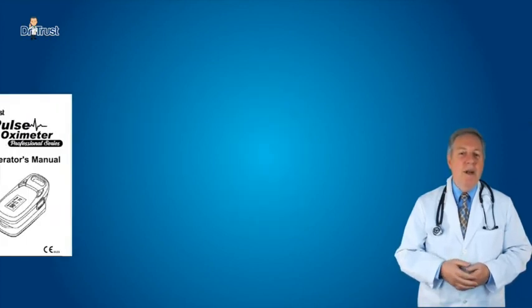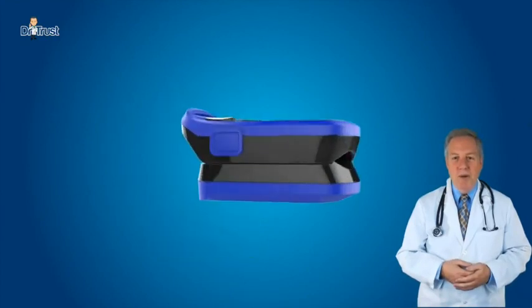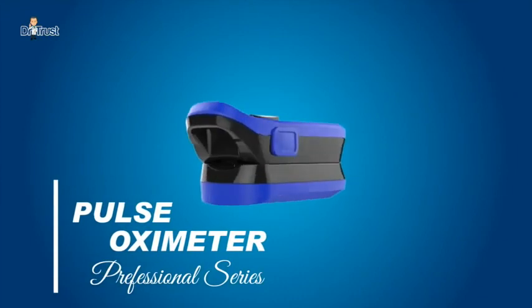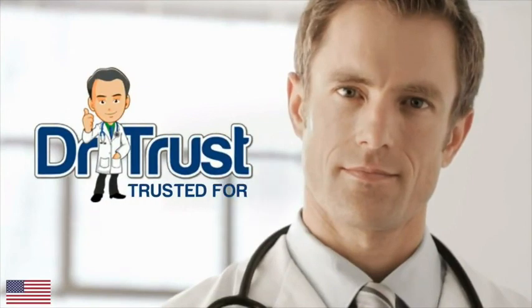We also recommend reading the manual provided with the product for safety information and product troubleshooting. Dr. Trust — trusted for life.